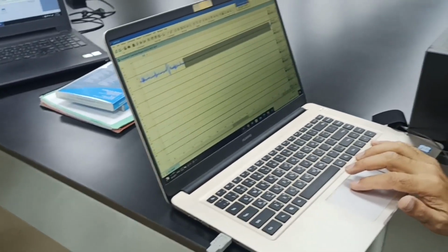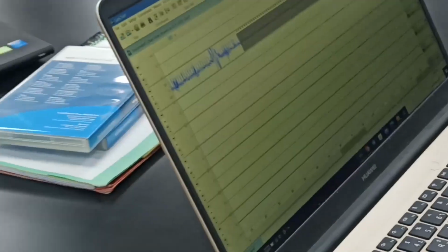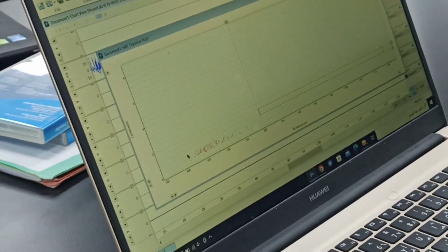All right. So what we can do next is a beat classifier. This also would help us in actually achieving the same objective which we have done through settings. Okay. So beat classifier, it is showing all the beats.